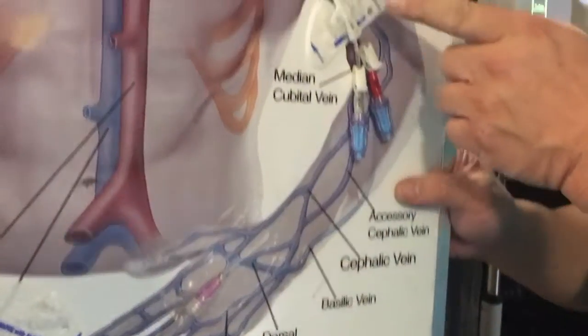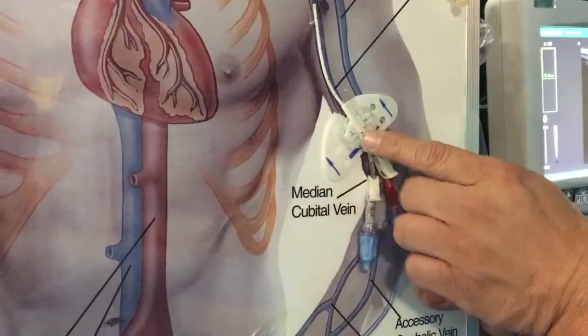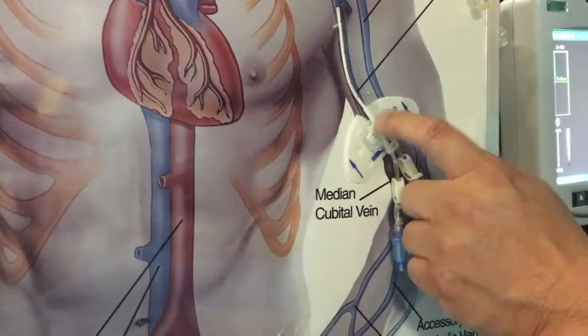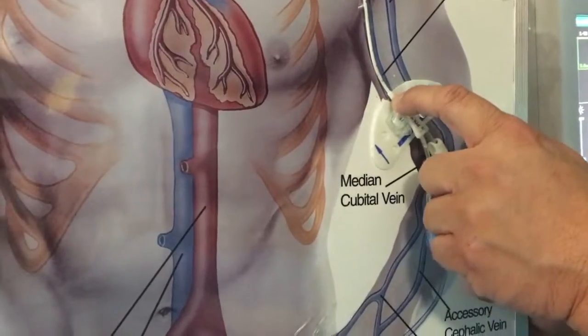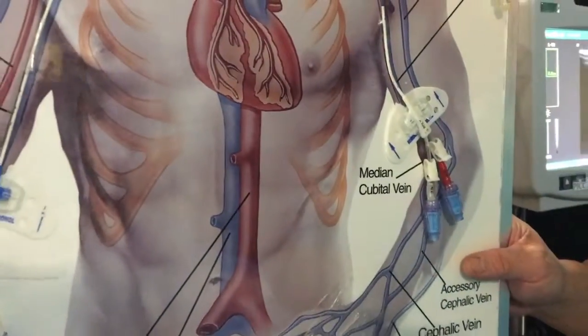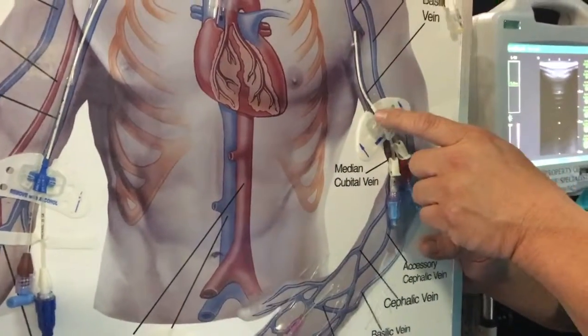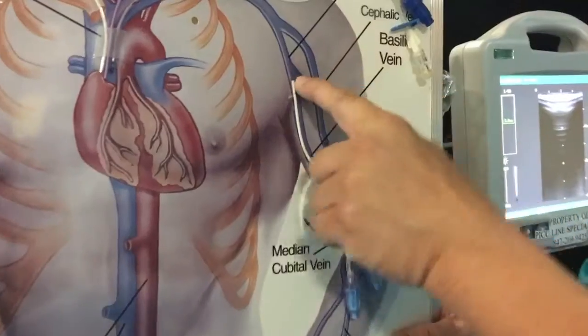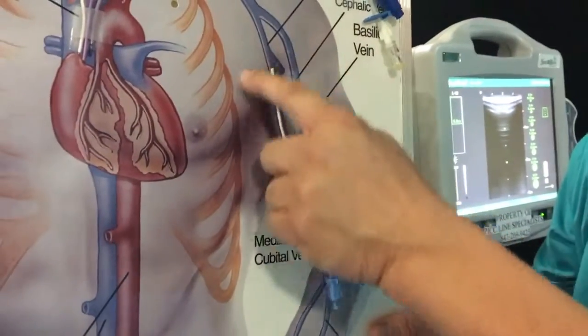Then you have your midline, which is again a catheter that goes into the vein, but this time it will go into the big vein of the upper arm. The distinguishing factor is that with the midline, the tip of it ends in the armpit area. Okay?